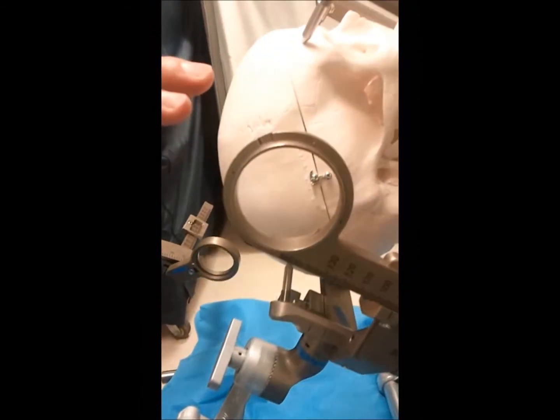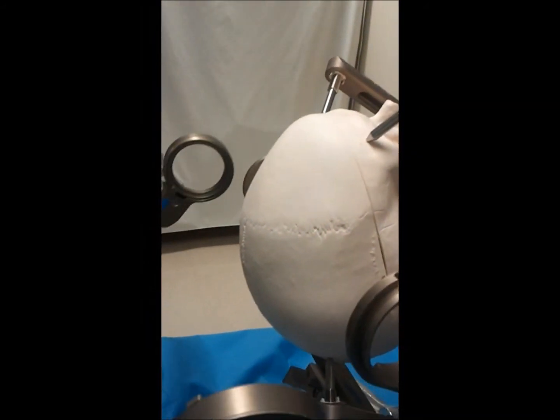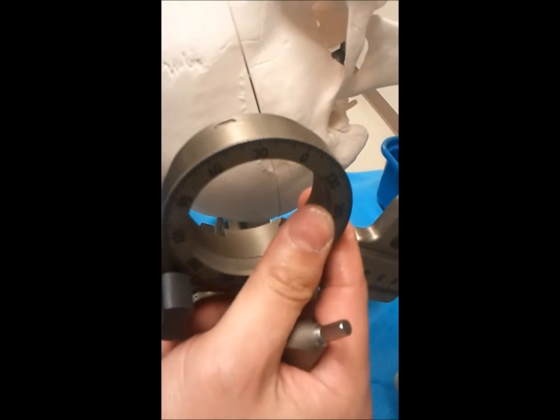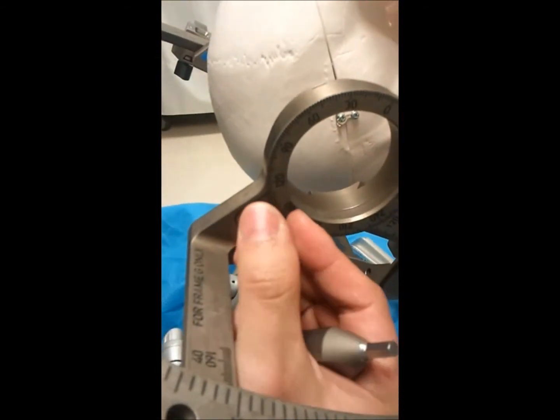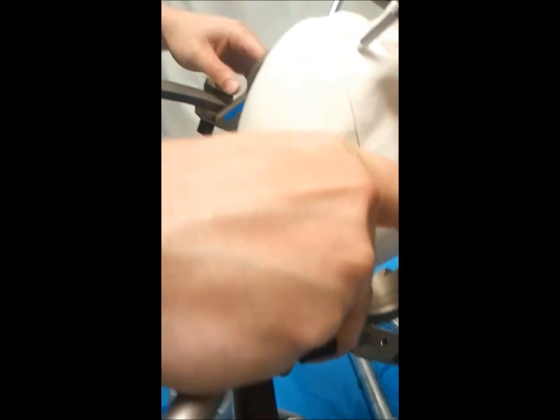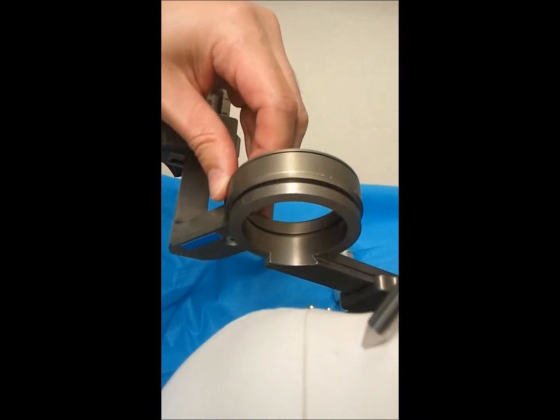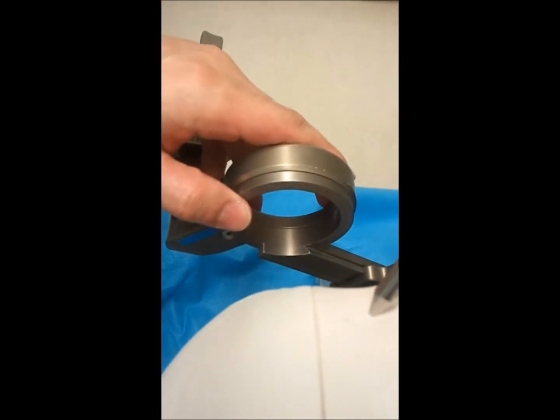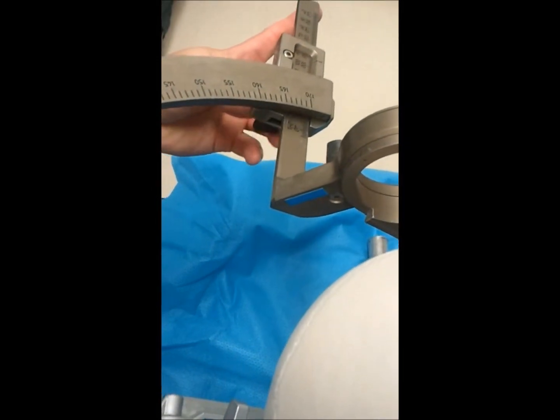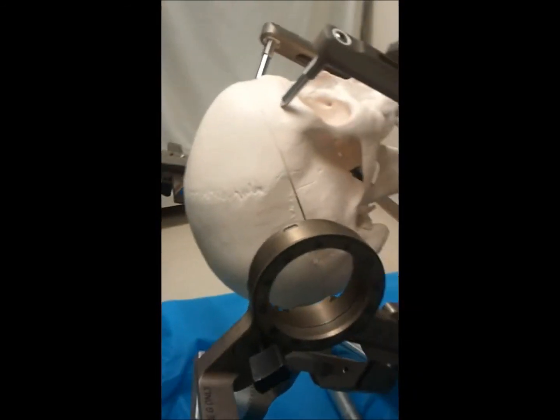Then having the patient draped, and then cutting holes for the drape, placing this on with the right side first, ideally with an assistant, okay, and this needs to be slightly loose to give you some play, and then lining up this notch by sliding this left lateral component into the ring and lining those notches up. Then after that is fixated appropriately, pushing this, making sure this is pushed in, and then tightening that. Obviously if you have an assistant it'll be a little easier. Tightening that so now you're secure.